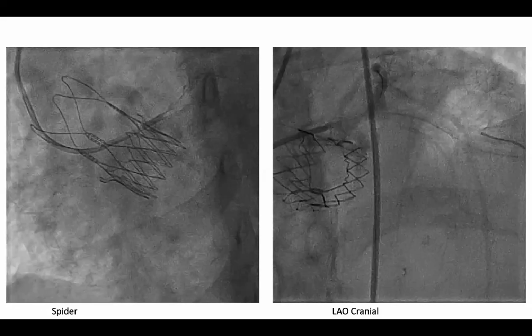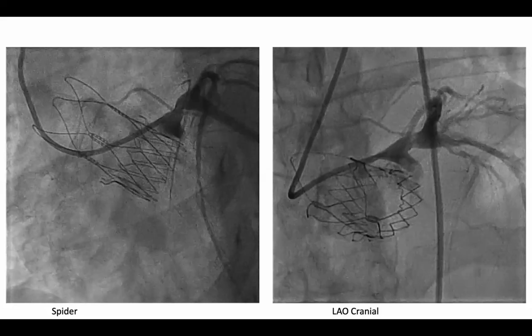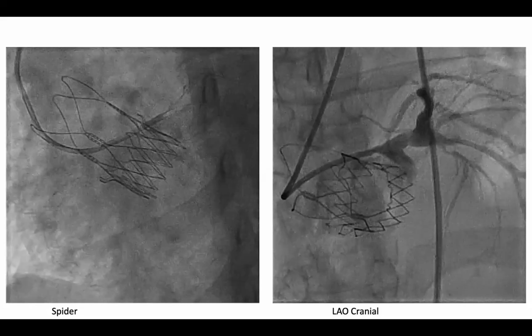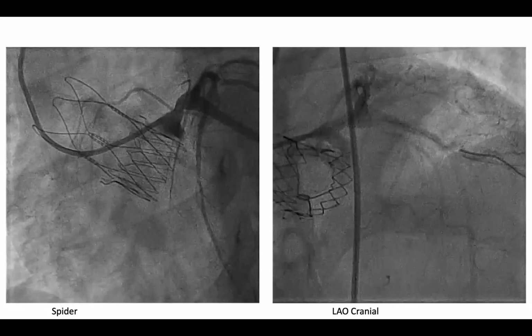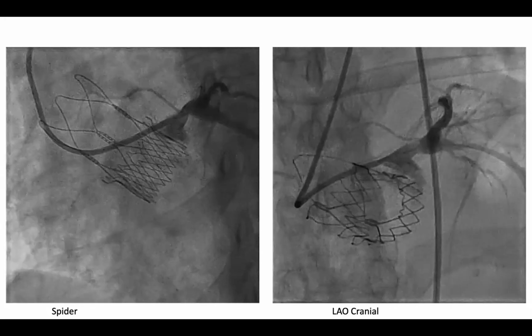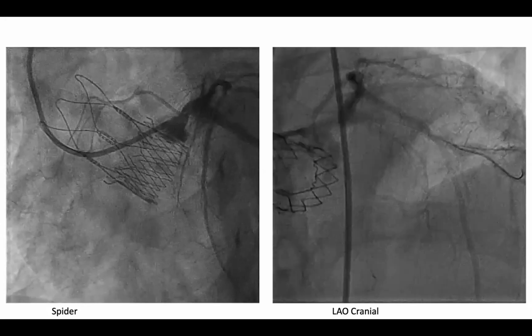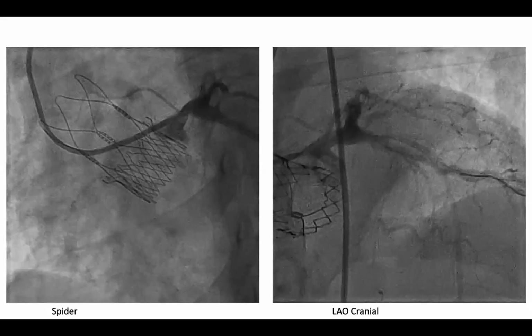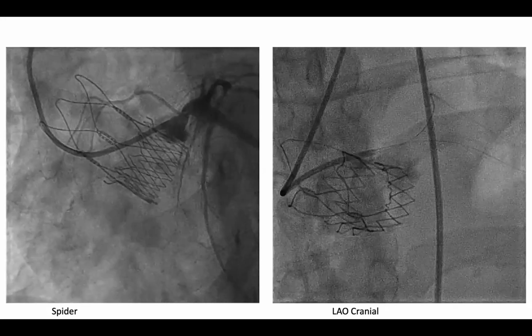So we felt that we have to investigate the coronary system properly before we think that this could be a problem with the valve. Plus the patient is there on the cath lab table anyway, so why not investigate her for the first problem at hand and then move on and exclude the second problem.